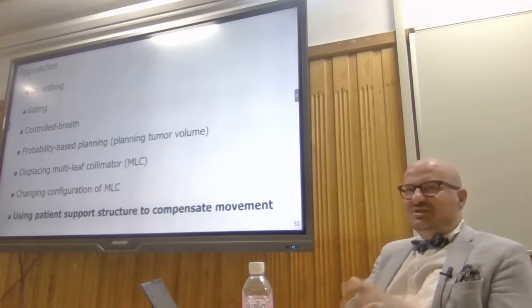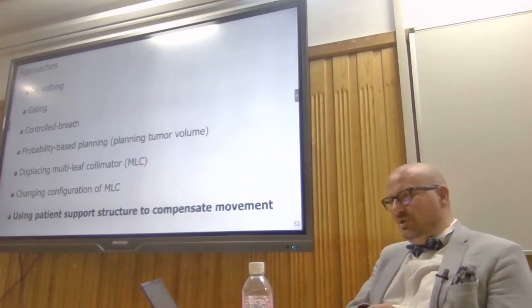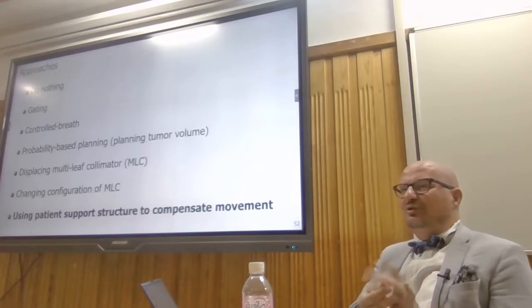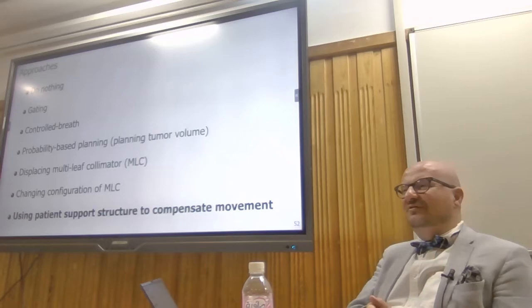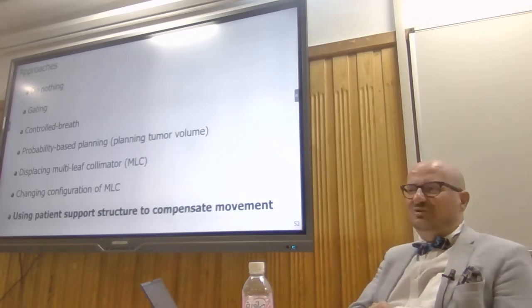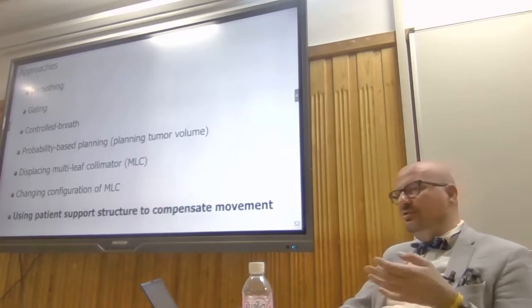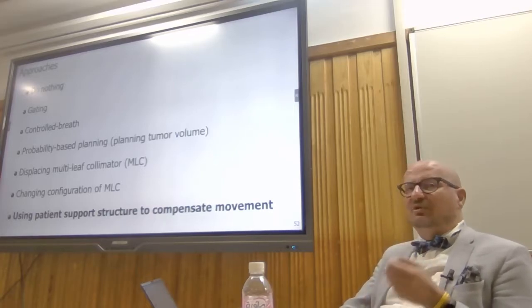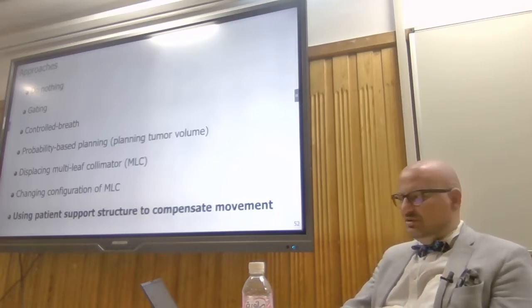As scientists and engineers, of course, we did not go to radiotherapy, but we did these experiments ourselves. So when we had the software to control this device, we just tried to lie on the device and see how it moves and how you feel as well. And actually, literature also shows that people don't have issues with this motion, so you don't get motion sickness.